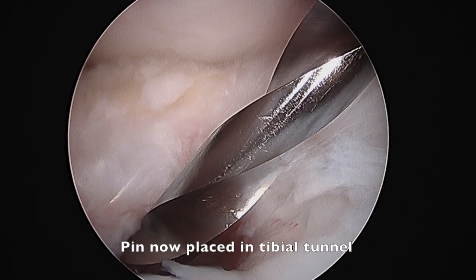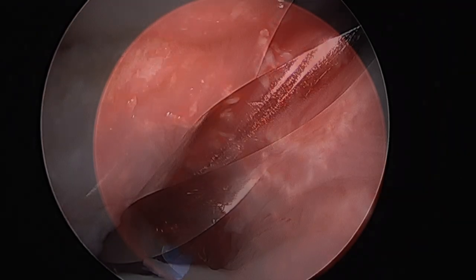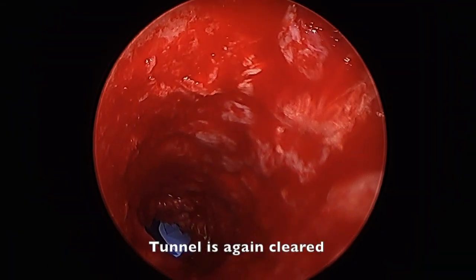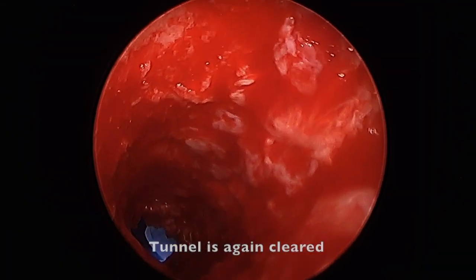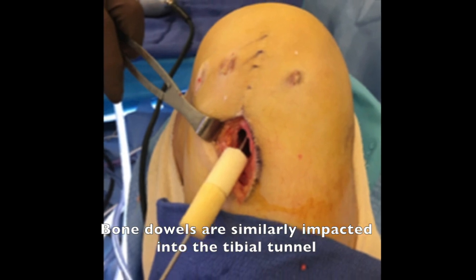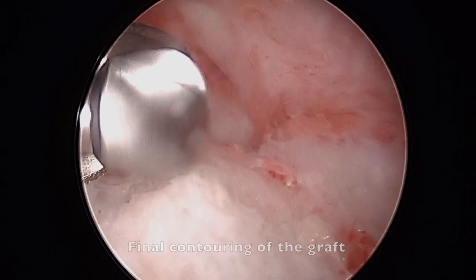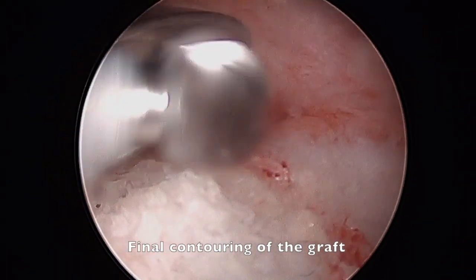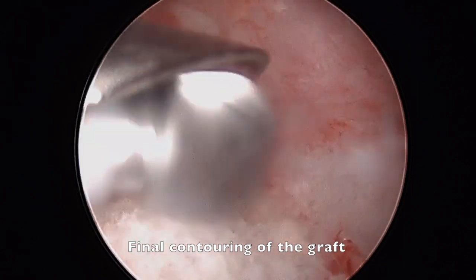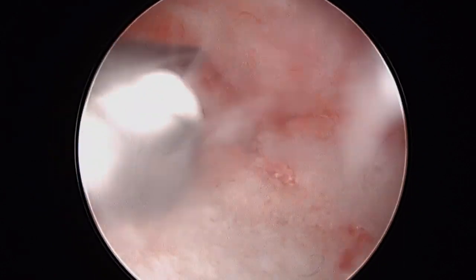Similarly, a pin is placed in the tibial tunnel and sequential reaming is performed to clear the tunnel to a fresh bleeding surface of bone. The bone dowels are similarly impacted into place and then excess bone is again removed and contoured.